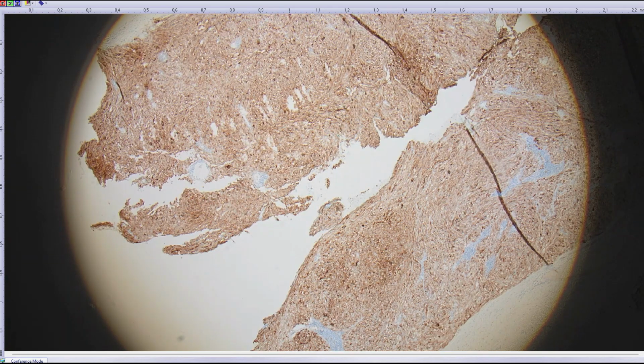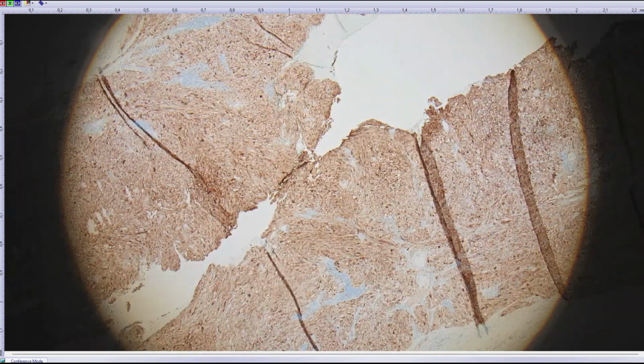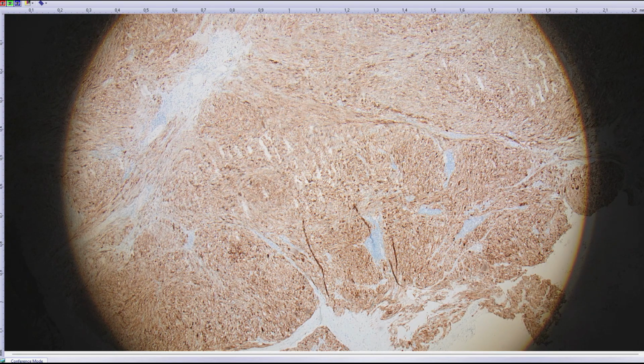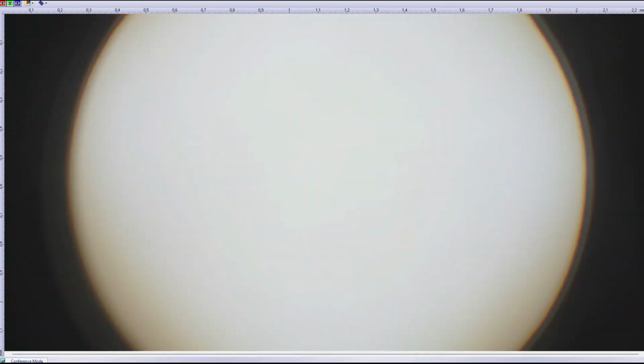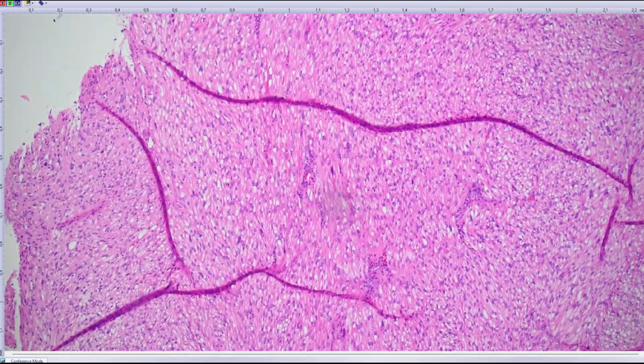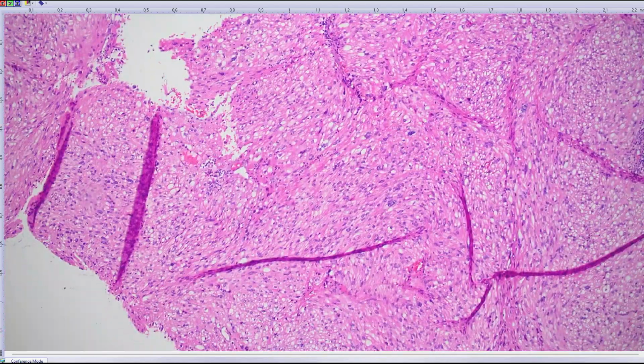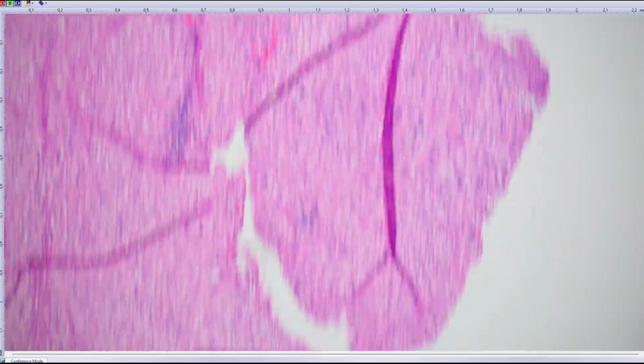We also did genetics to find the TSC1, TSC2 mutations, which are commonly seen in PEComa, but it was not there. There was just a TP53 mutation, which is often in PEComas, but it's also often in leiomyosarcomas. So it was the differential we were stuck with. I think the morphology doesn't look like leiomyosarcoma that much. It's more PEComa-like. And also we did methylation analysis.